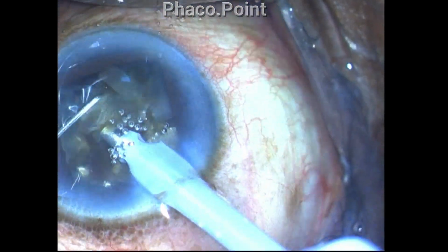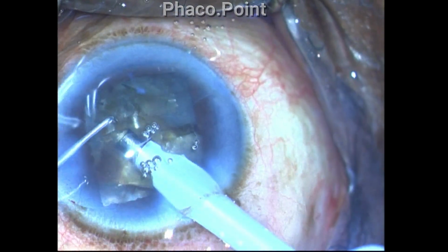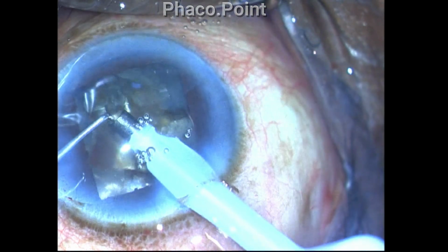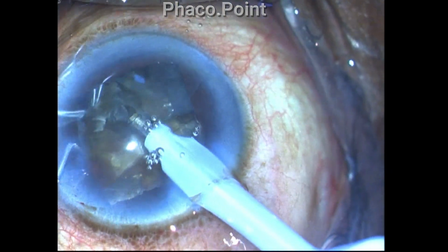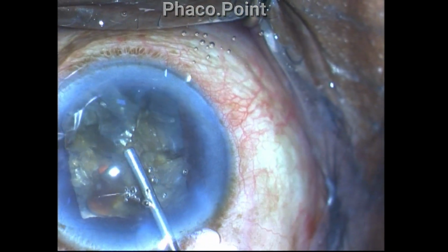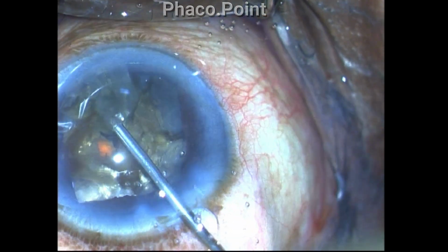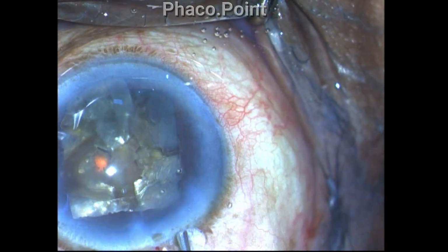Because the capsulorhexis is pretty large, I am able to mobilize the nuclear fragment, and I am in the burst mode and I am trying to eat up the piece when the Descemet membrane detachment once again occurs. This is probably because of using the high vacuum. And this is a Venturi machine also, where the vacuum does not happen on occlusion, but it is on demand. So once again, go beyond the area of detachment, inject viscoelastic, a heavy OVD, which is Viscoat, and I find that this is enough to resettle the Descemet membrane detachment.